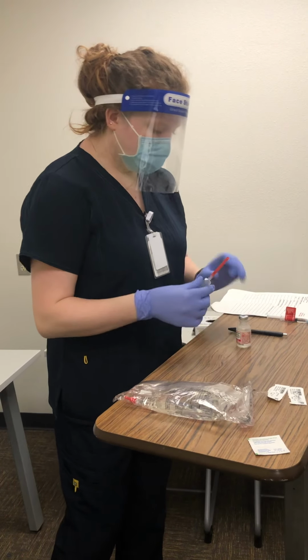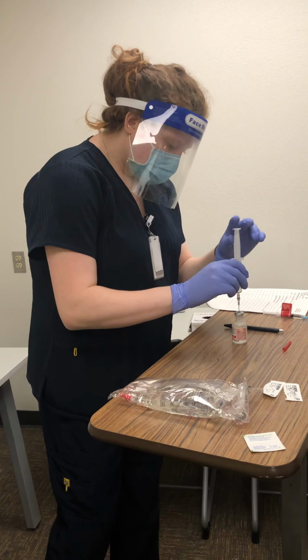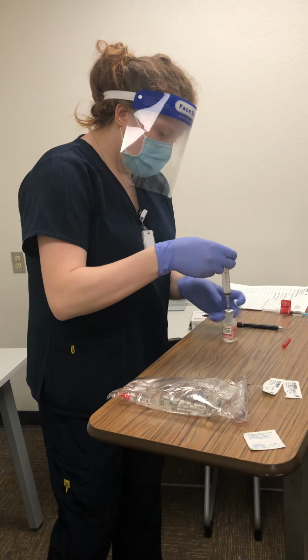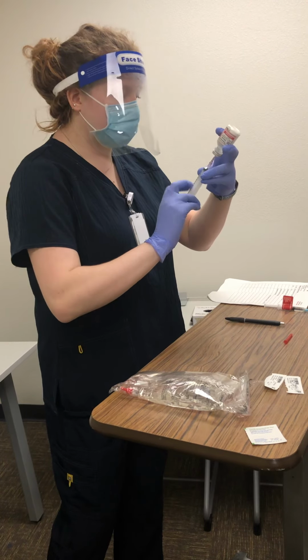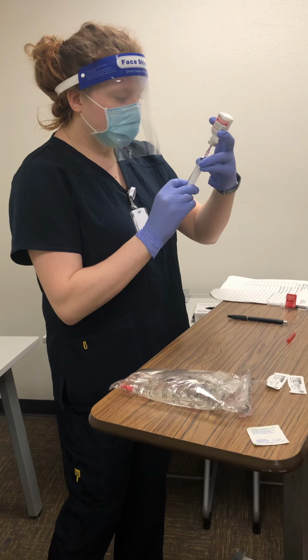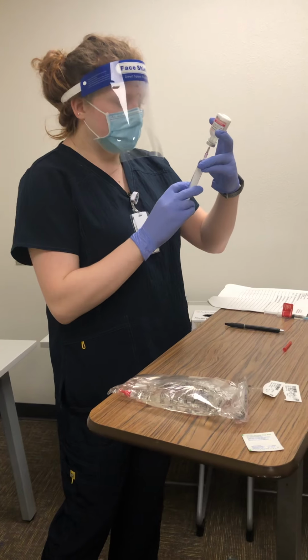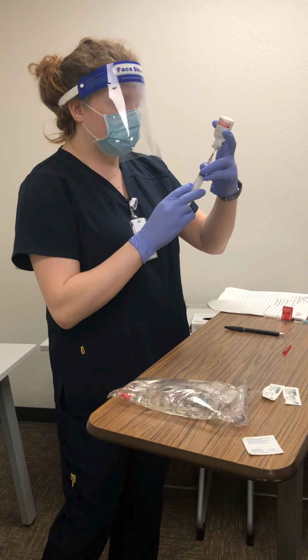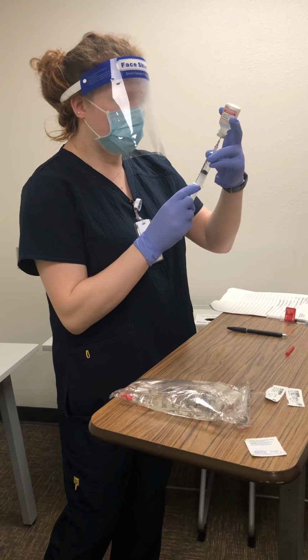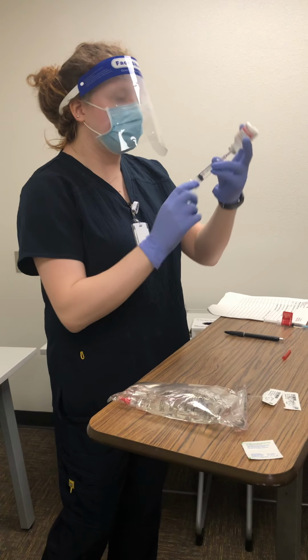Okay, that's dry. So we're going to inject the 10 mLs of air. Okay, and now we are withdrawing. Okay, and this demo bottle has been very used, which is why it's leaking. In real practice, we would not use a bottle that is leaking so much, or leaking at all, I mean. Okay, we're at 10 right there.